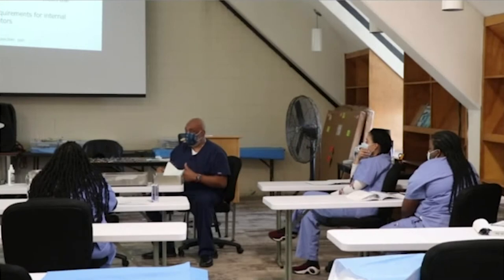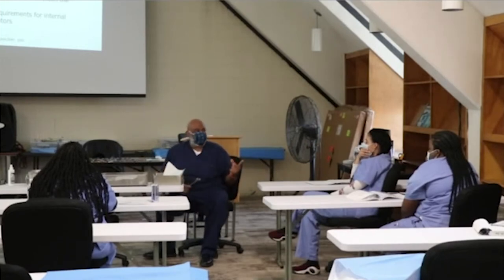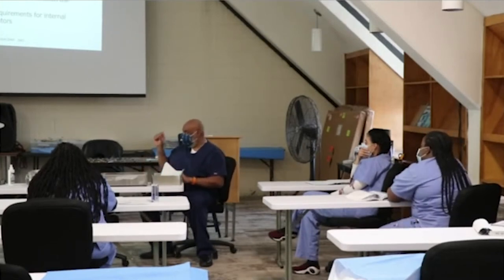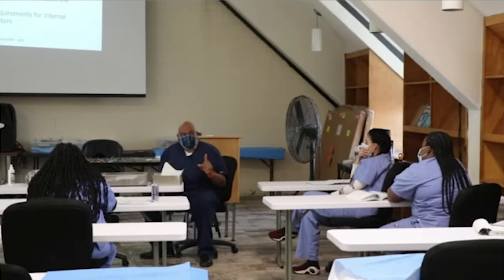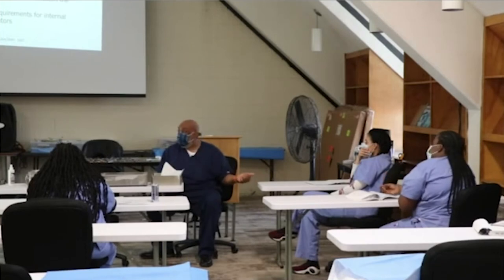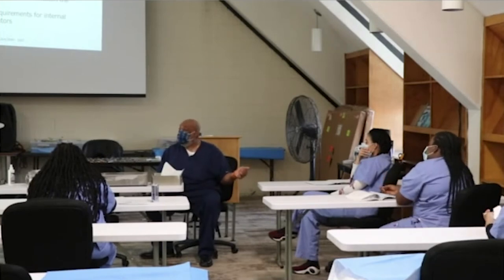Take a few minutes. Also with your light cords. Your instruments that have to be tested, your batteries, your light cords, we were talking about PSIs, right? With your PSIs and your light cord, there's a cord that's attached to it. Most departments have invested in a light cord tester. It's just like at home, how you would test your light, make sure that it works.